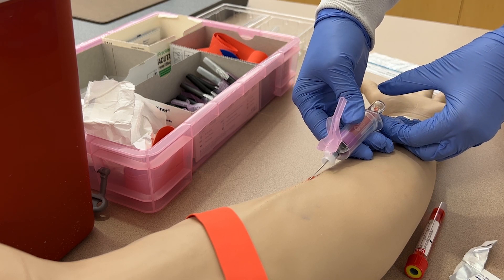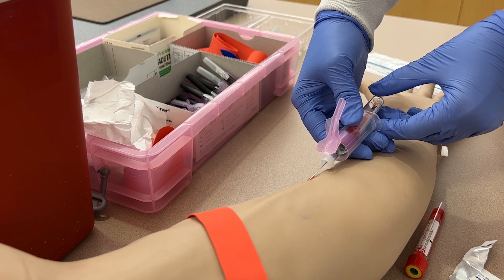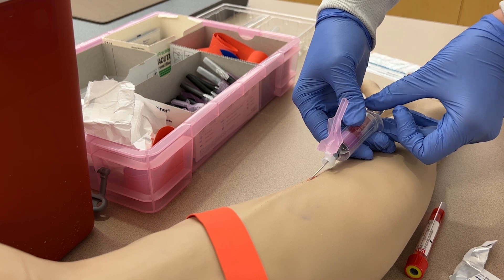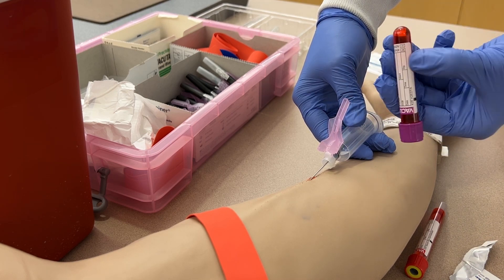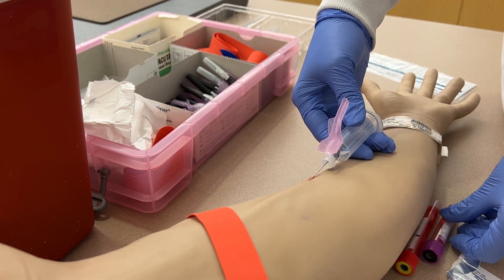The entire time your hand is holding steady against the patient's arm. Once that tube has filled, pop it off by placing your middle finger under the tube, your thumb on top, and using your index finger against the ledge of the tube holder. Gently invert the tube to mix the blood with the anticoagulants and then set it to the side.